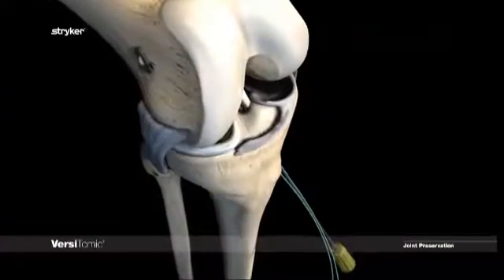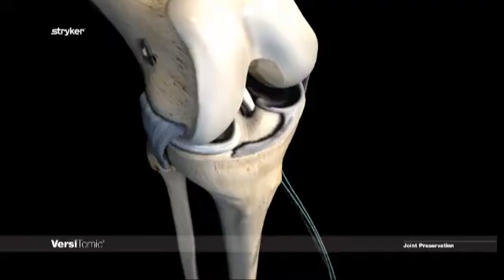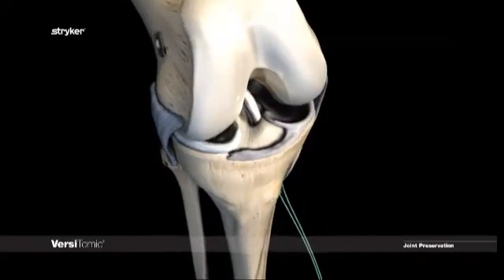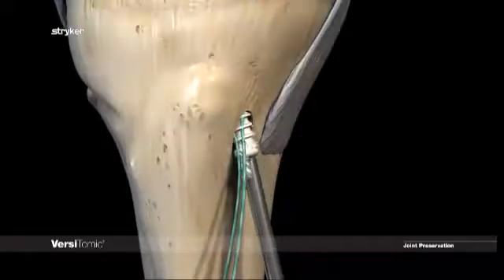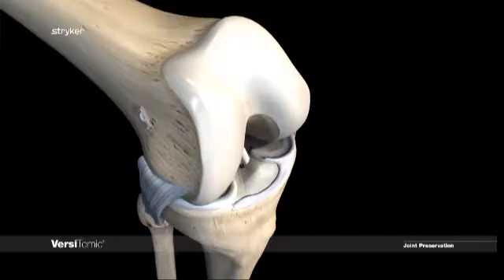Unscrew the rod for removal. Use one hand to lightly pull back on the handle while the other hand does two 180-degree turns. Tibial graft fixation is performed with a Stryker Biostian Interference Screw.